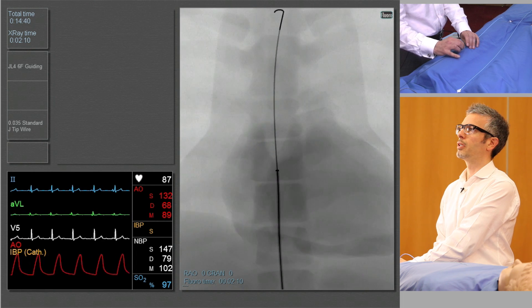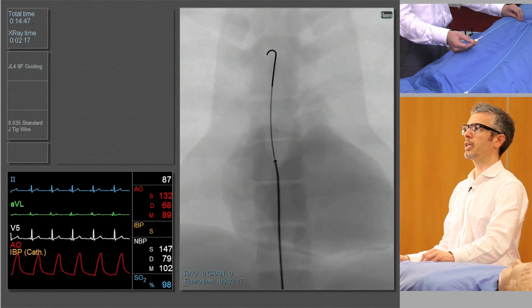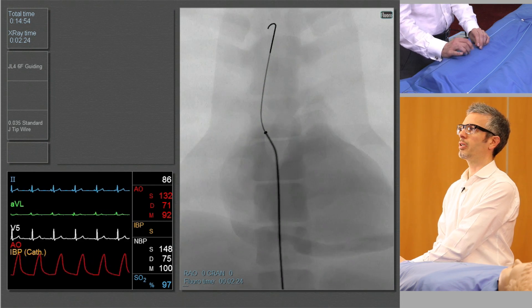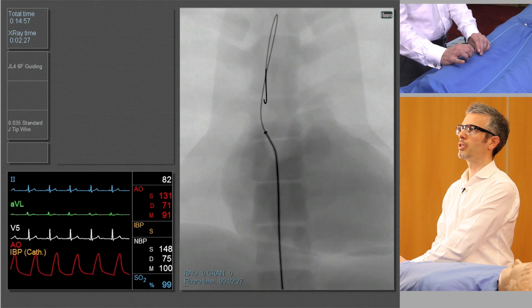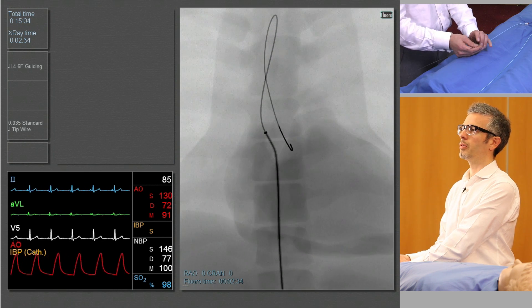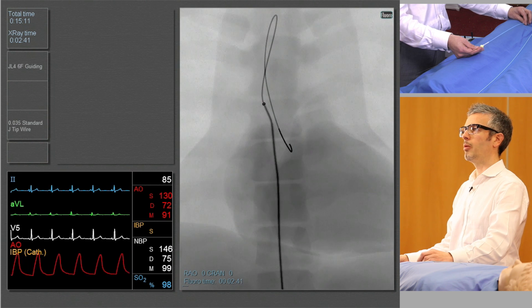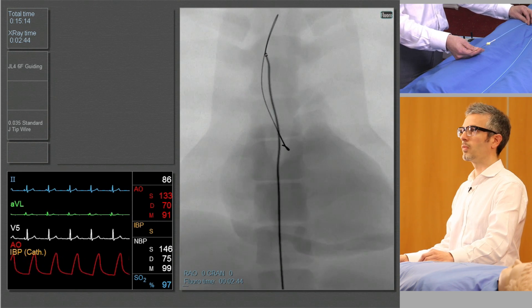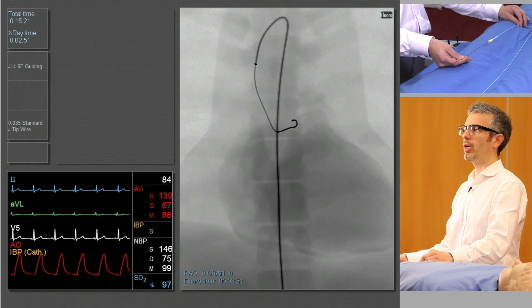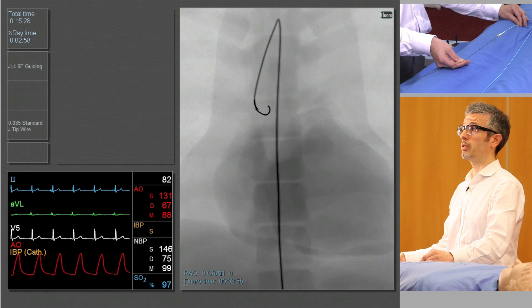We're coming up towards the aortic arch and you can see it buckling up and heading into the subclavian. So I'm going to bring the guide catheter a little bit closer to the tip, put some direction towards the left hand side of the screen, and hopefully that'll just take us round the arch. You can see me advancing the wire now and I'll feel some resistance as it comes down onto the aortic valve. I'm fixing the wire with my right hand and with my left hand I'm advancing the guide catheter. I'm keeping my eye on the tip of the guide wire to ensure it doesn't move anywhere I don't want it to go — specifically not down into one of the coronary arteries.